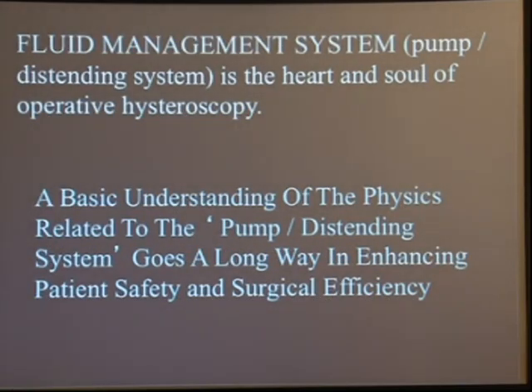A fluid management system is the heart and soul of operative hysteroscopy, and of course a pump system which is very specific to pressures, flow rates and absorptions is the most essential component for operative hysteroscopy.